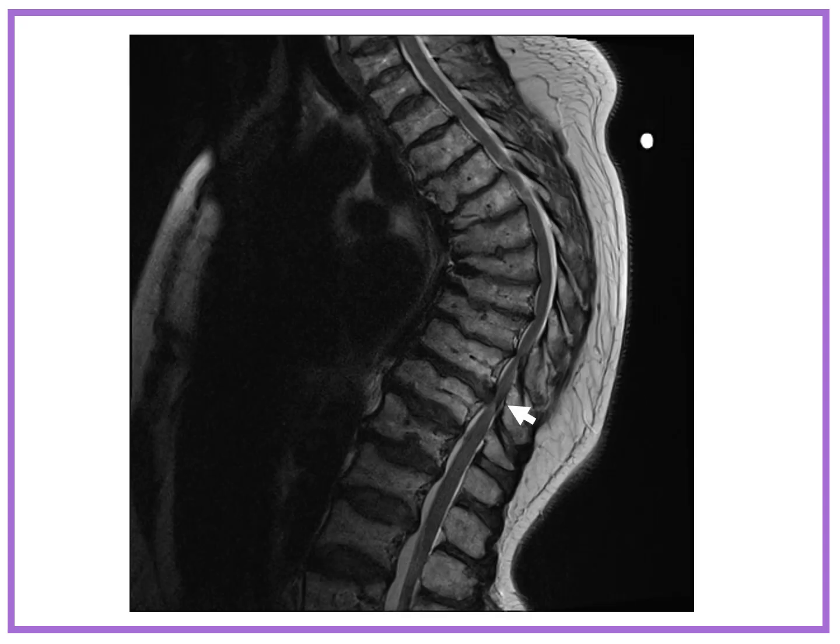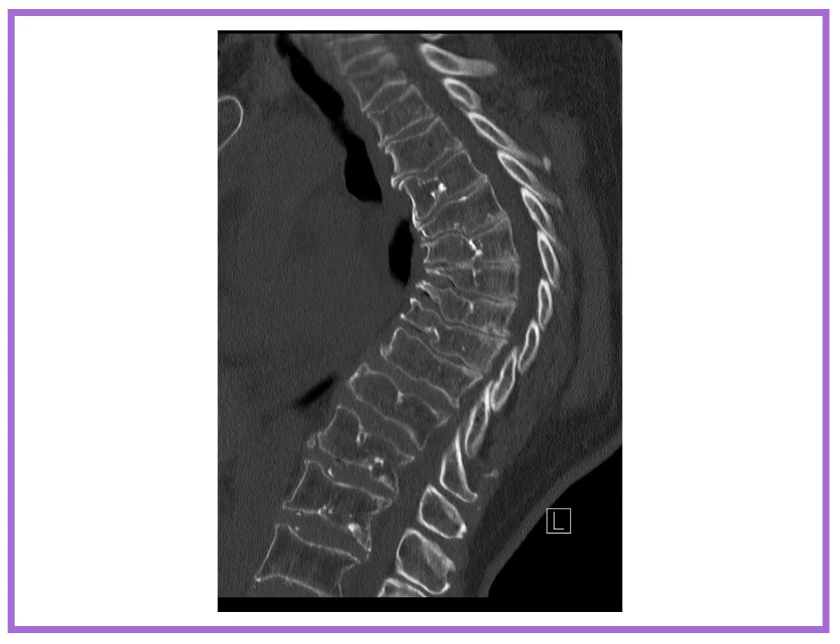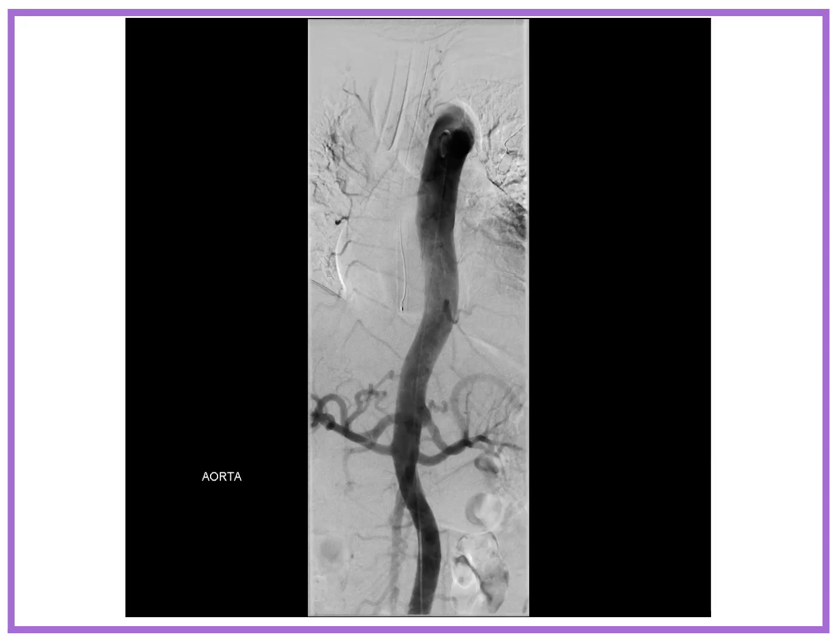So this is an individual with a particular syndrome that we will not discuss too much in consideration of privacy. As you can see, there's some spinal cord compression at the lower thoracic level, right here. And so what we are asked to do is an angiogram to identify the anterior spinal axis, or the radiculomedullary contributions to the anterior spinal axis.